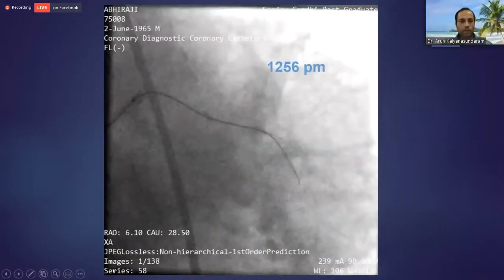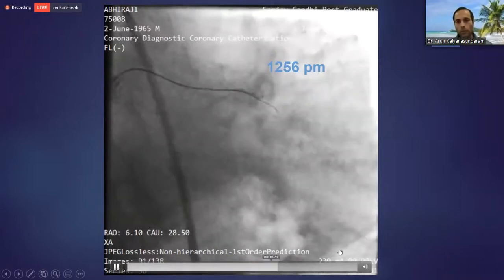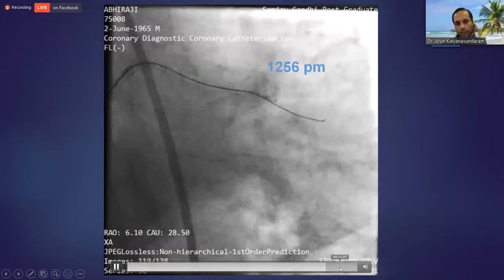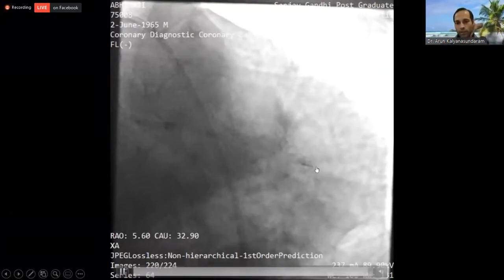So 30 minutes after we decided to knuckle, I ended up doing a blind stick and drive with a Conquest Pro 12. Once you're there, we're still not done. Exchange for a workhorse wire, always. So that's the microcatheter. Exchange for a workhorse wire.